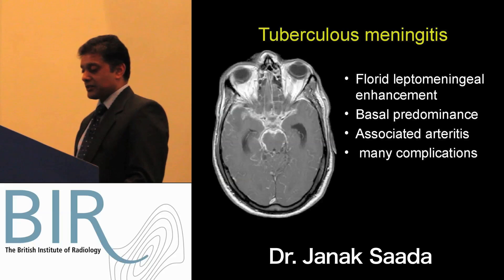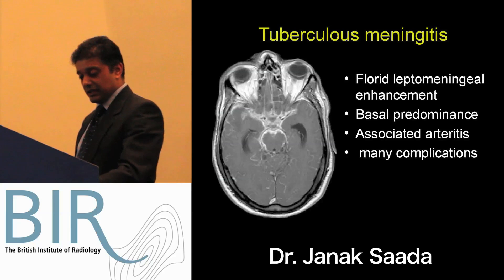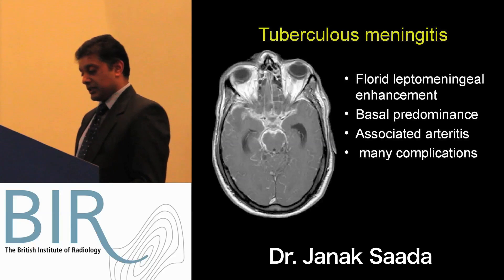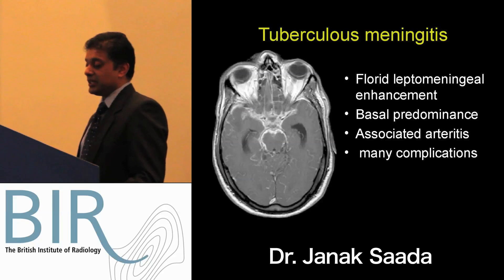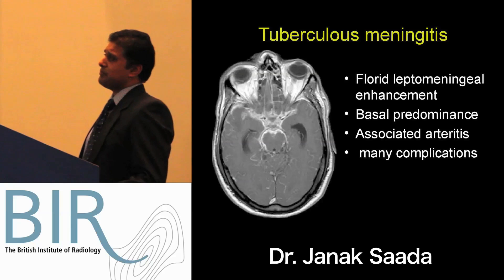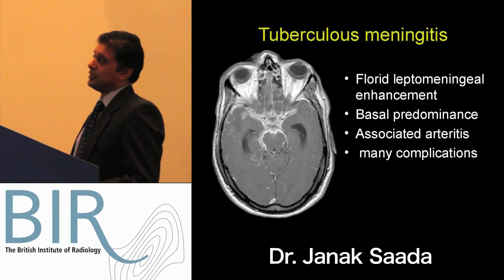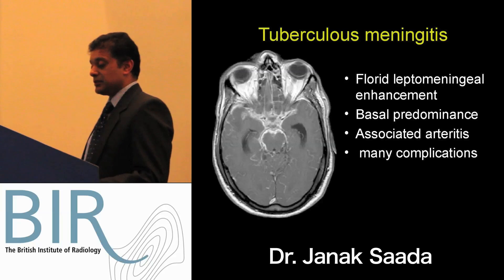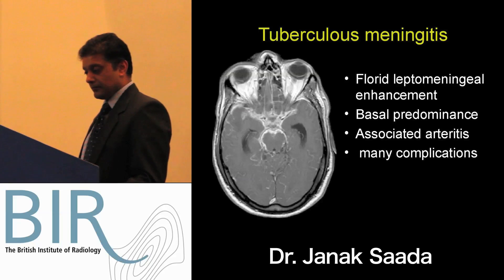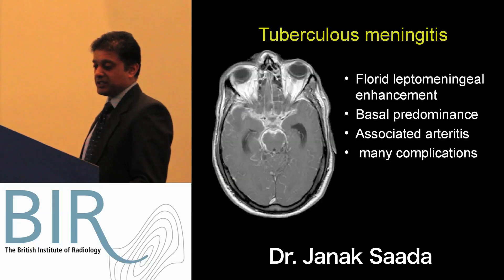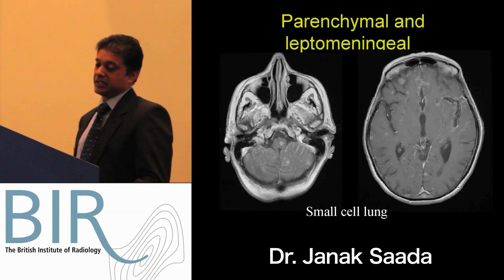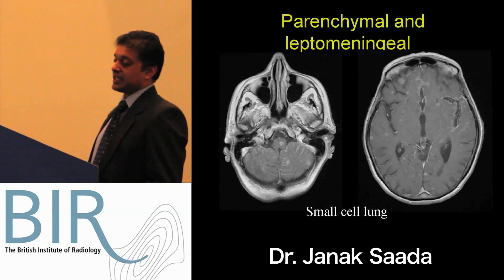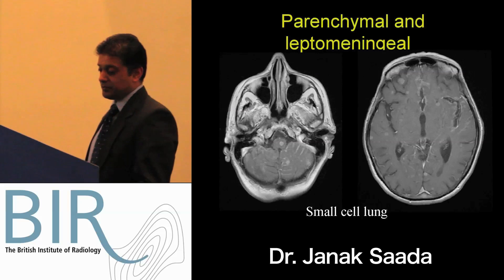This is a very characteristic pattern of basal meningitis seen with TB, but you can also see the same pattern of leptomeningeal malignancy with carcinomatosis and sarcoid. Here is another example of leptomeningeal enhancement in the setting of small cell lung cancer metastatic disease, both in the CSF as well as in the parenchyma.